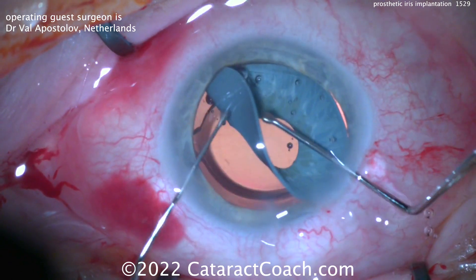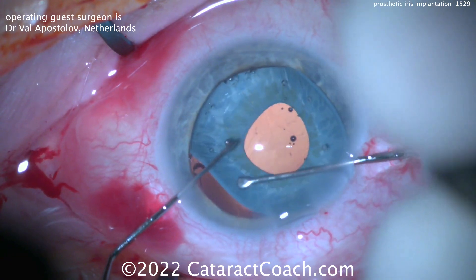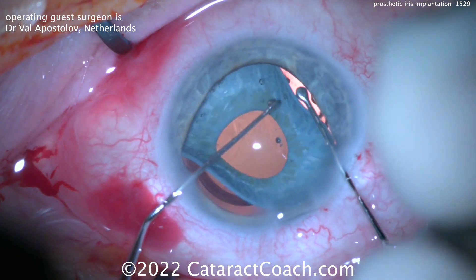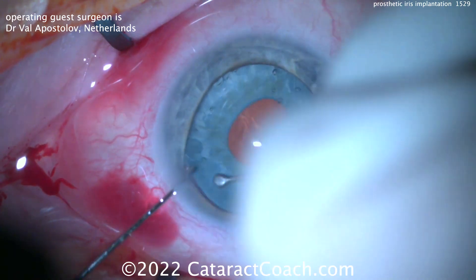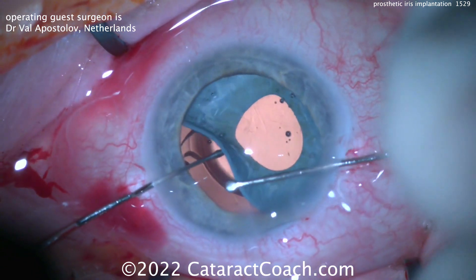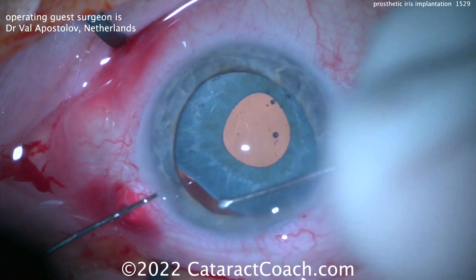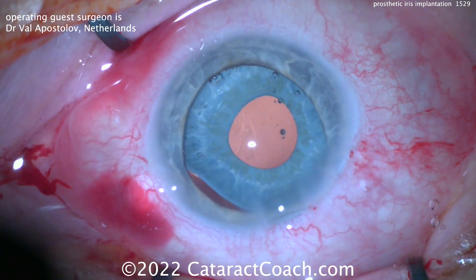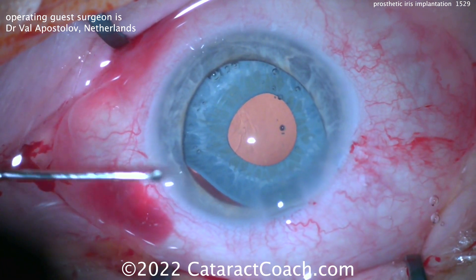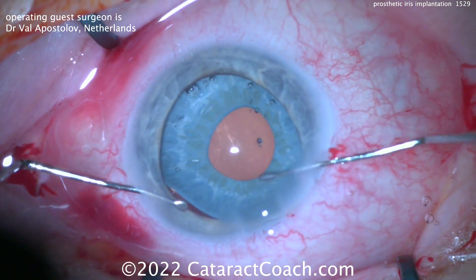Trying to push this device into the capsular bag is not going to be simple. You can get most of it in, and it's just the very last part that becomes tough. This device is meant to sit in the capsular bag — it's not meant to go into the sulcus. The capsular bag in these cases is probably about 10 millimeters wide as it's stretched out by this device, maybe a little bit more. You can also trim these to size if you desire.